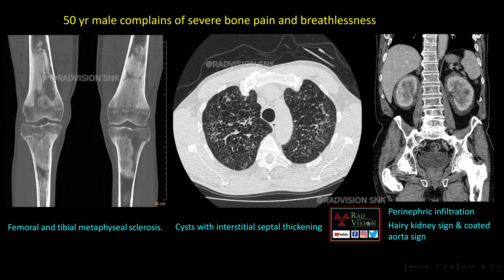Next — 50-year male with complaints of severe bone pain and breathlessness. Here you can see there is femoral and tibial metaphyseal sclerosis. Here you can see there are multiple cysts noted in the upper lobes along with interstitial septal thickening. Also, there is soft tissue infiltration noted in the perinephric spaces symmetrically — the classical hairy kidney sign. Similar soft tissue can also be seen along the aorta, which is called the coated aorta sign.